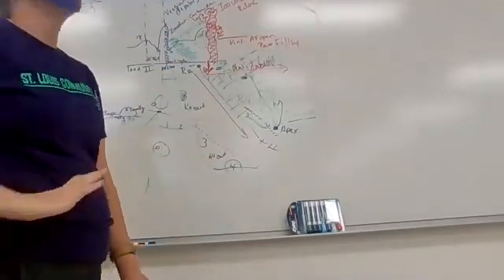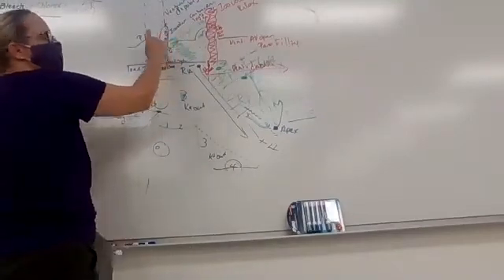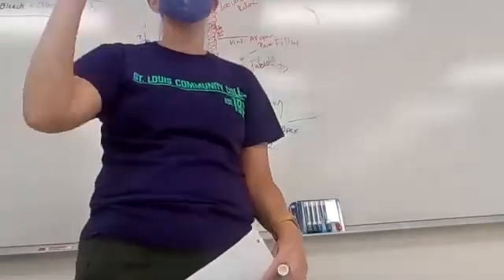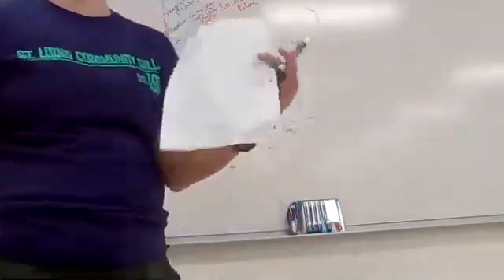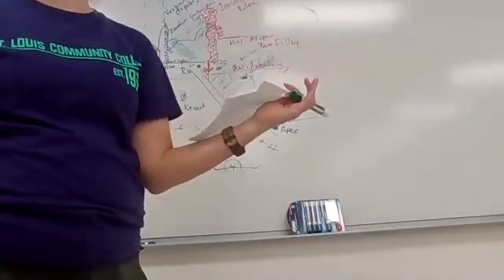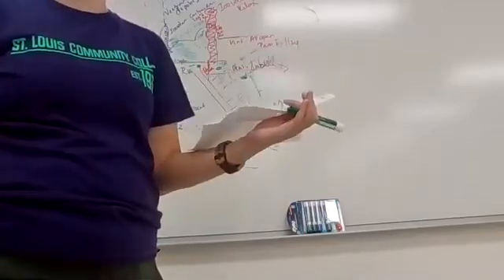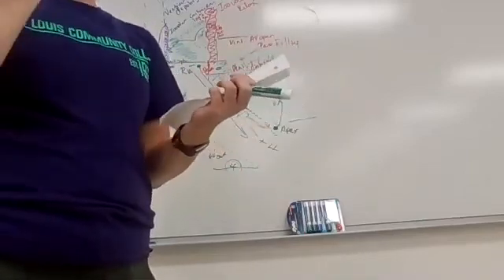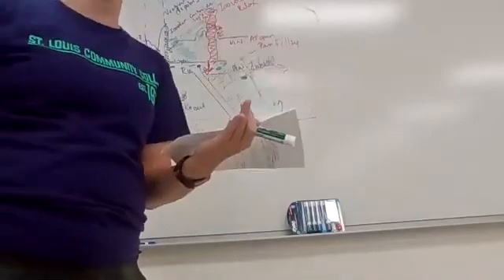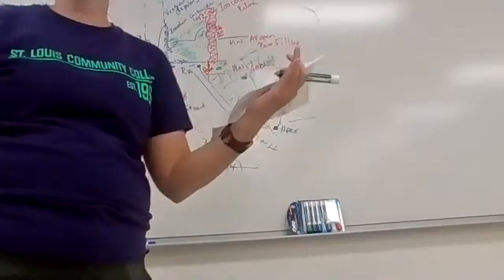Okay? Normally when you walk up to an EKG, you want to count the number of QRS complexes, and that tells you how many ventricle contractions you have. If it's a 10-second EKG, how many contractions did they get out of their ventricle in 10 seconds? If they had 7 contractions in 10 seconds, then what would you say their resting heart rate is laying there?